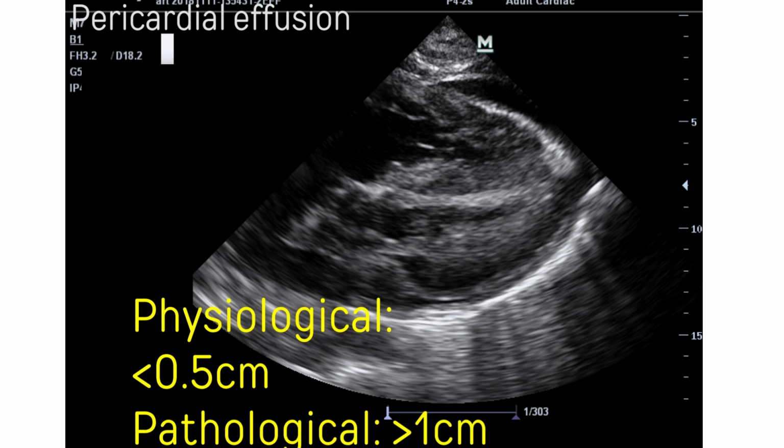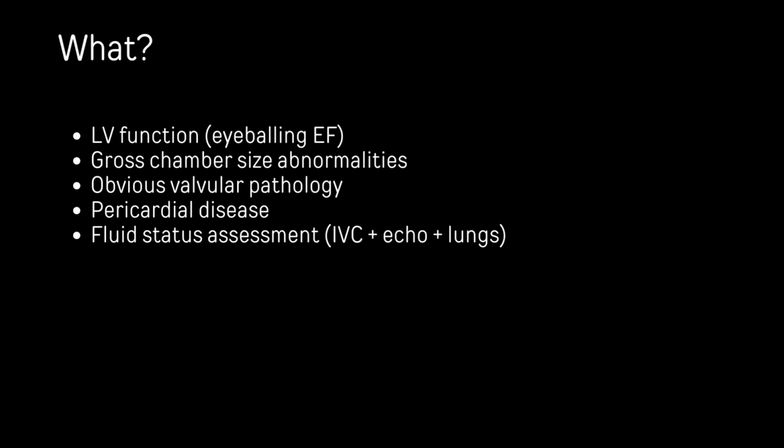So we're quickly going to run through the basic stuff just to remind you guys. What are we going to look for? And luckily, eyeballing the EF is fine. That's good enough. You don't need to be able to calculate an EF.